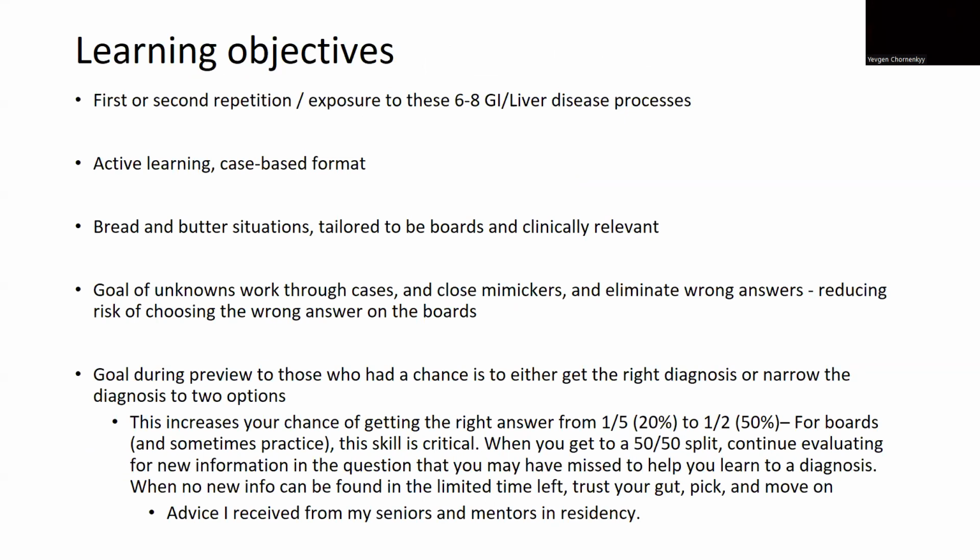The learning objectives: there are 8 cases. We may not be able to get through all 8. We might get through 4 or 5, and then whatever's left over, I'll try to finish off at 5 p.m. in a week or so. It's just exposure to some of these cases, doing some active learning, looking at some bread and butter cases and some maybe harder cases.